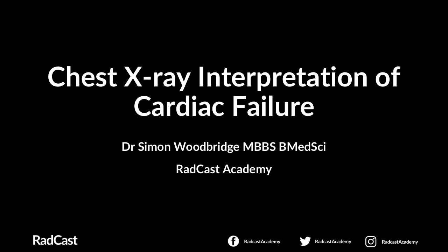Hi there everyone, welcome to this RadCast Academy tutorial on the interpretation of chest x-rays in the context of cardiac failure. My name is Simon Woodbridge and I'll be presenting this talk, which is mainly focused on an overview of the use of chest x-rays in the acute setting to help identify and diagnose heart failure, alongside a brief look into the main principles of chest x-ray acquisition, as well as the pathophysiology of heart failure to tie everything together and provide some context into what we're seeing on these chest x-rays.